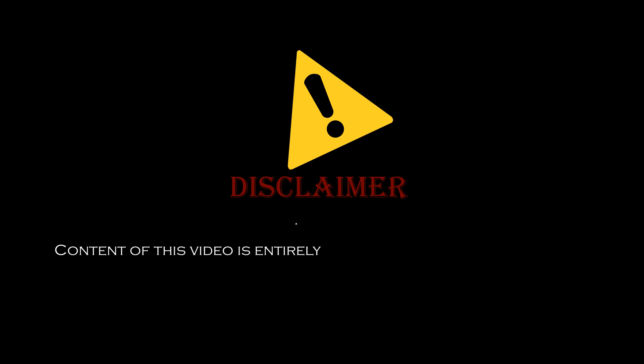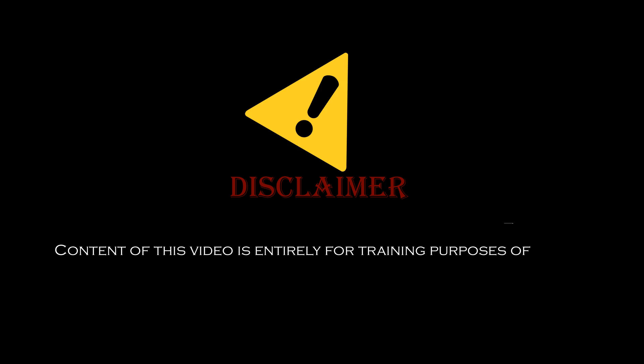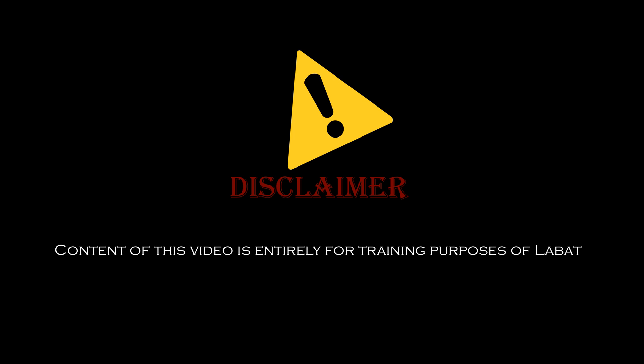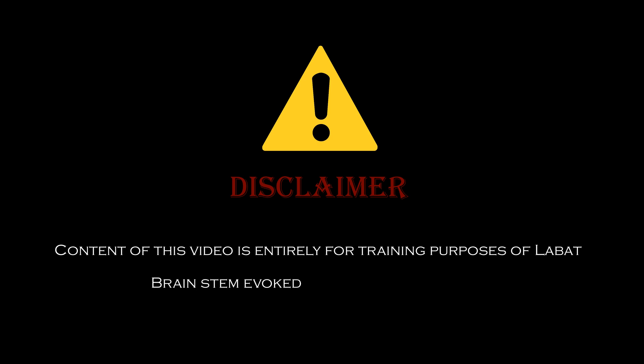Disclaimer: the content of this video is entirely for training purposes of Labat brainstem evoked response audiometry.